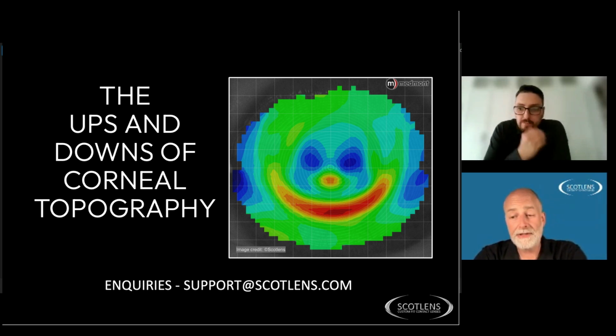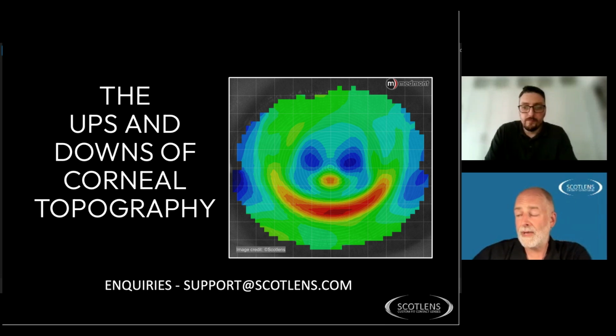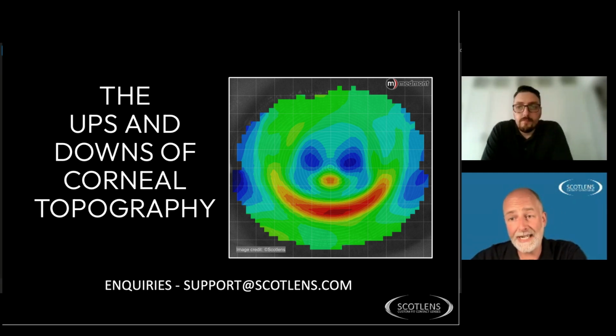If somebody's got severe dry eye, it can impact the quality of the topography. For example, the patient I showed at the end with the omega-3 supplementation: the first captures I had of her were only 4 seconds, as she could only hold her eye open for about 4 seconds. I knew there was an improvement the second time I saw her when she held her eye open for 10 seconds.